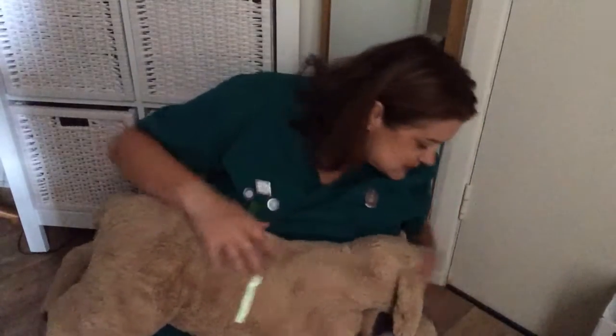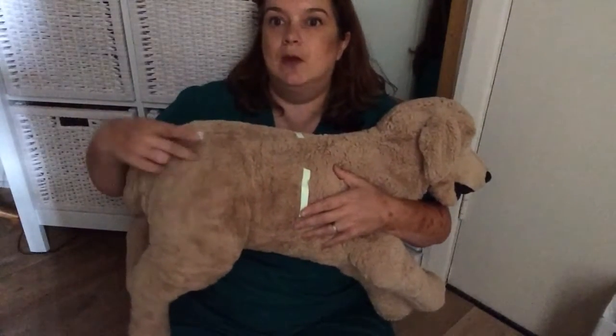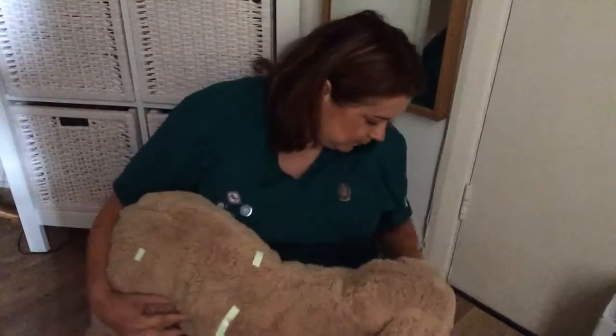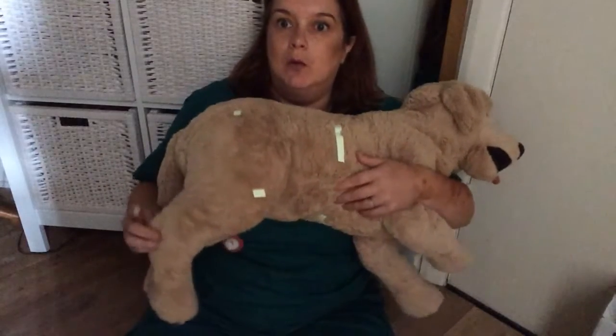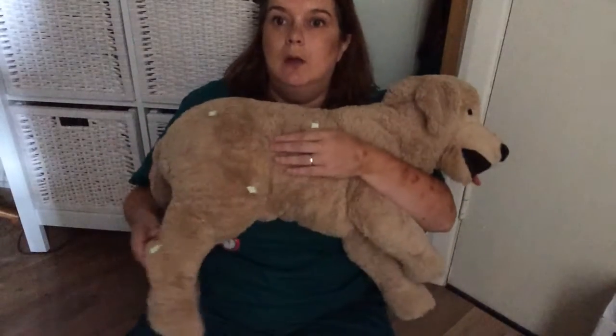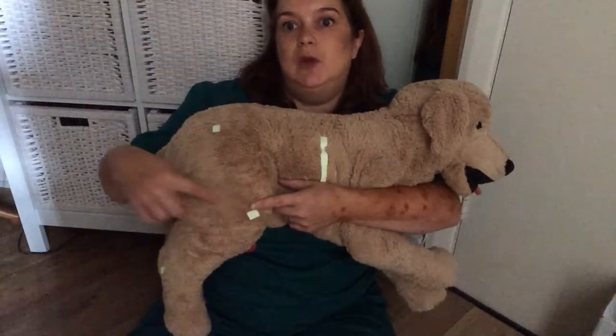So my little glow-in-the-dark stickers — he's got quite a big bum here, so my hip joint is up about here. Then we have the stifle here, quite nicely pronounced. And then the final one — where actually is our hock? Our hock is going to be here, and I'm going to put it at the caudal aspect. So you're going to have to take an x-ray that is centered in between the stifle and hock, and it's going to be collimated to include both these stickers.